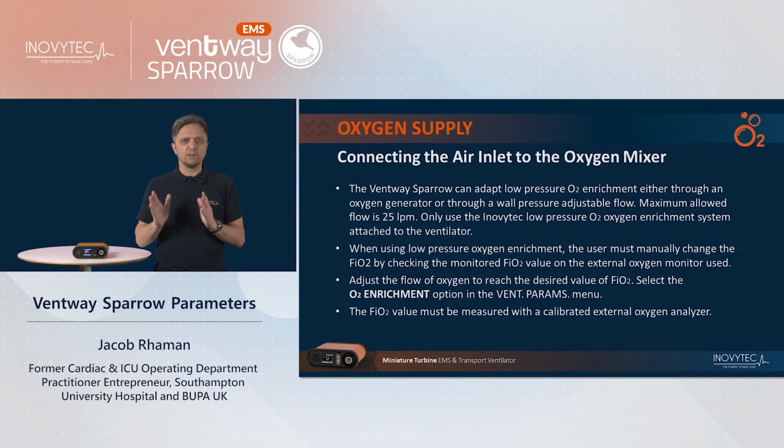The oxygen enrichment device is fitted to the input of the ventilator and fully extended. It delivers low flow, with as little as 1 to 2 litres per minute, with the inspired oxygen concentration reaching as high as 50%. This makes for a very low consumption of oxygen and is ideal for lengthy patient transfers.